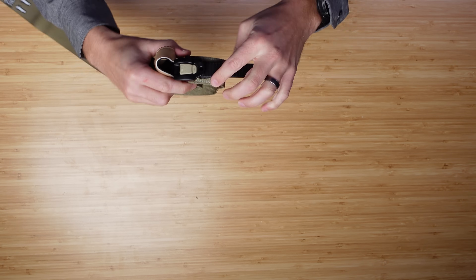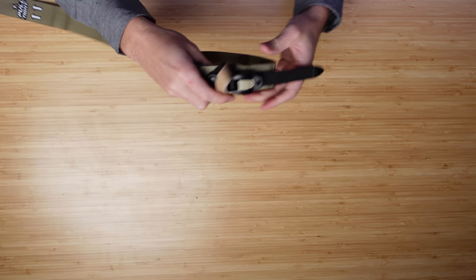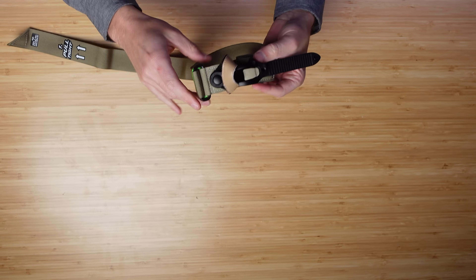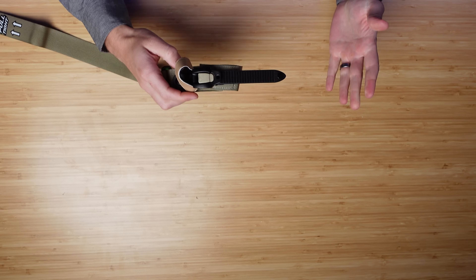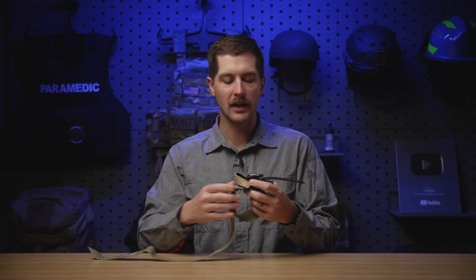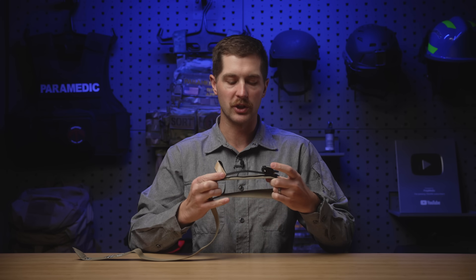As you can see, this has a ton of take-up — even more than a windlass-style tourniquet. If it was not put on completely tight to begin with, you can make up some of that slack much better than a CAT tourniquet, in my opinion. Get it really tight until blood flow stops. If you need to release it or it's being taken off, you just unhook it just like that.